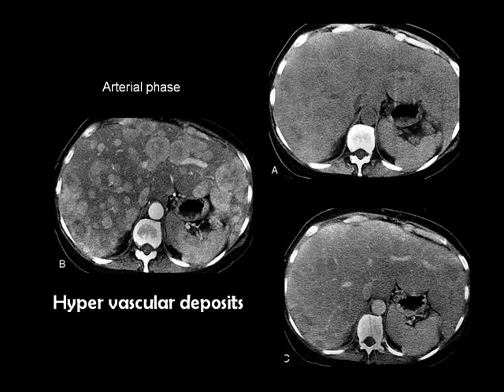Then you get a scan which is known as the triphasic study of the liver, which is the essential or mandatory examination for detection of any liver pathology nowadays. There is no way to detect liver lesions accurately without this study. How can you know the triphasic study when you are looking at the film?